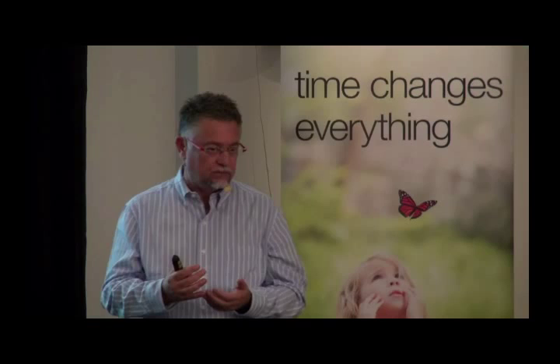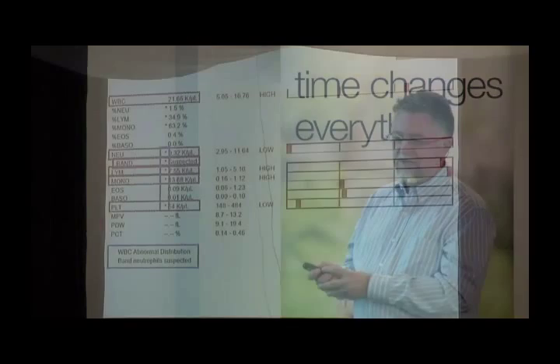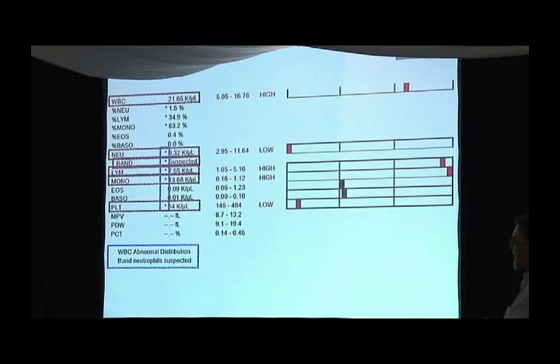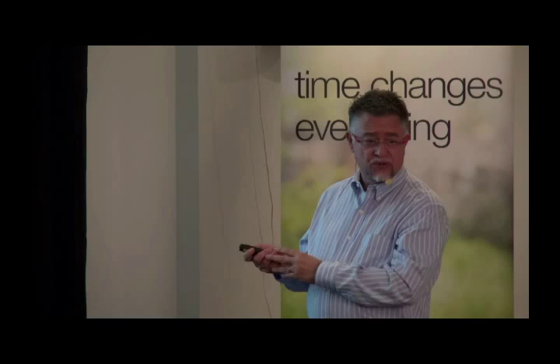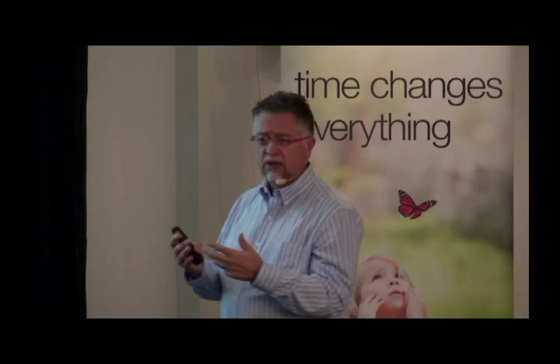It also gives you this little message that is conveniently placed where your left thumb will hold that sheet of paper, all right? So it will be right there and you will not pay attention to it. That thrombocytopenia is likely because she's bacteremic or she's septic. So again, don't pay attention to the number of lymphocytes because those are not lymphocytes, all right? Sometimes people get hung up on, oh, the ProCyte is giving me too many lymphocytes. Well, no, they're not lymphocytes because it's telling you, I think they're bands, right?